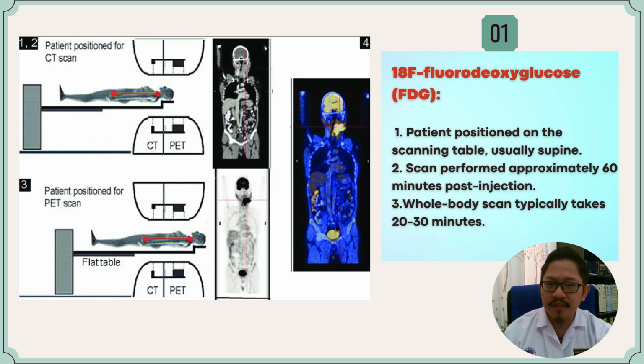First of all, the patient is positioned on the scanning table, usually supine, and the scan is performed approximately 60 minutes post-injection. The whole body scan typically takes 20 to 30 minutes.